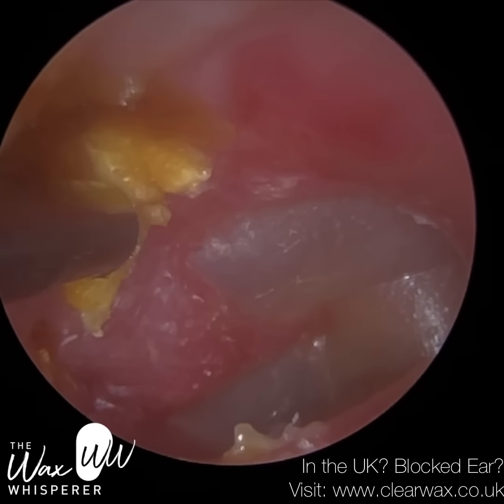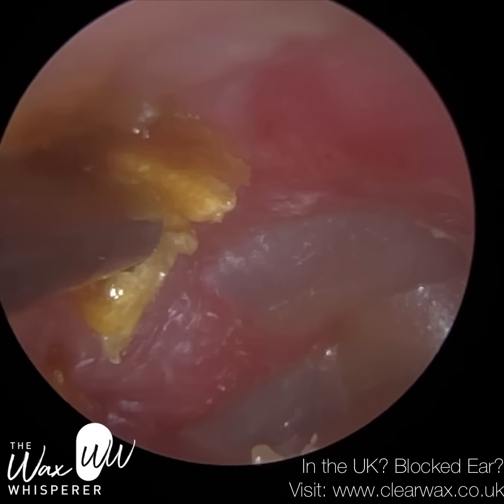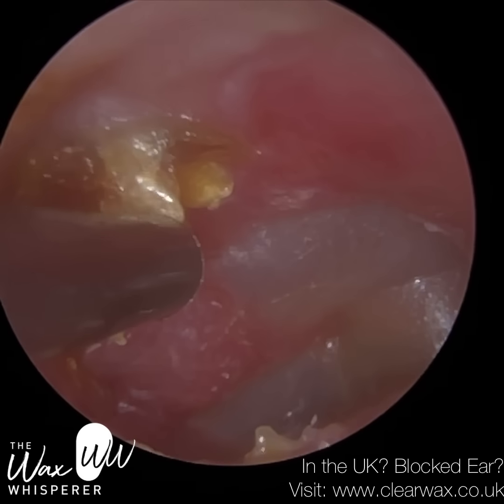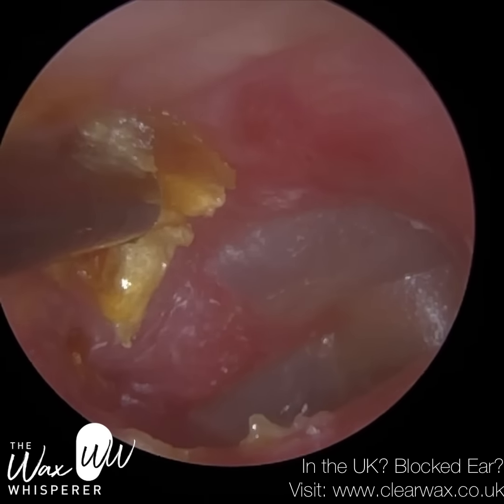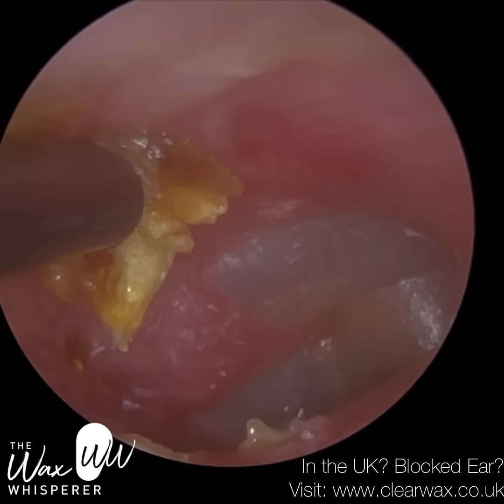I just want to remove this for two reasons. I just want to make sure there's not an underlying cholesteatoma. A cholesteatoma can be a life-threatening plug of dead skin that normally accumulates in the attic region or the posterior superior, so the back top part of the eardrum, where the eardrum can get sucked inwards. It can retract, buckle inwards. You get skin that drops and falls into that.